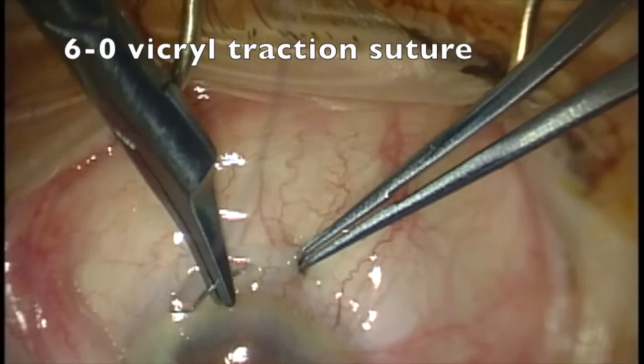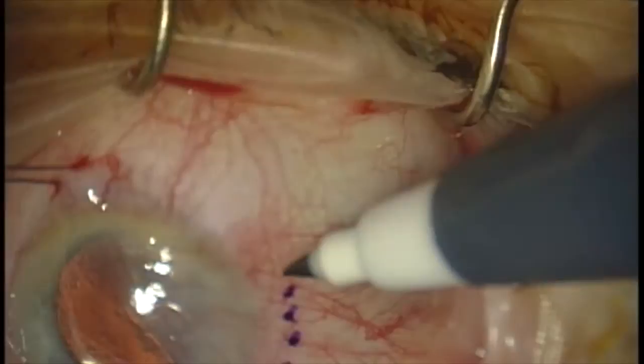This is Alex Cohen from the Dean McGee Eye Institute. I want to share with you one technique for performing pterygium surgery with an amniotic membrane graft.